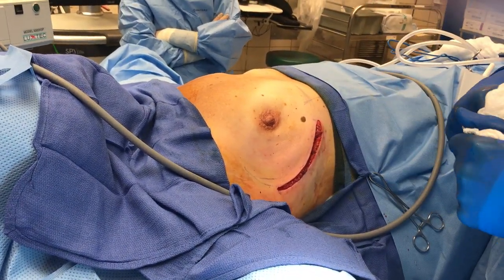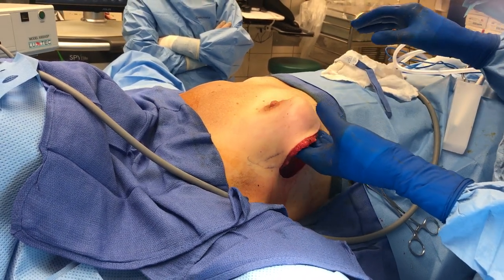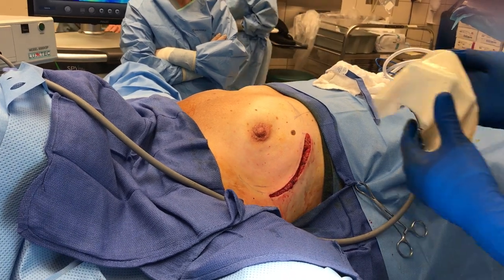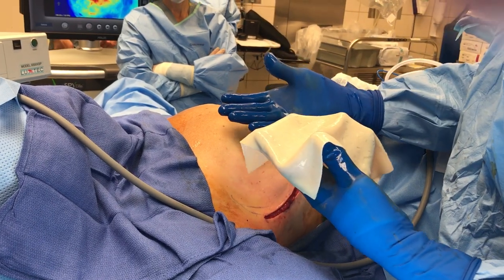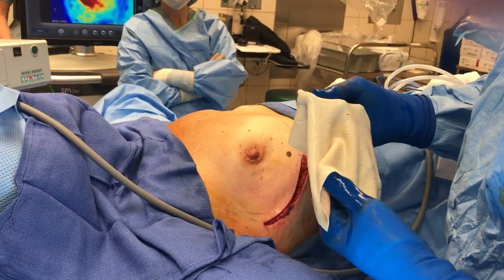The SPI showed great vascularity bilaterally, so we're going to go ahead and place the implant pre-pectoral with a dermal matrix graft. Here's our dermal matrix graft, which we're going to sew in all the way across, put the implant underneath the dermal graft on top of the pectoralis, and reconstruct the breasts.